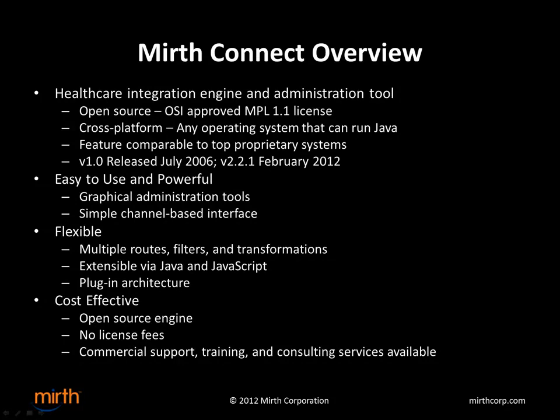So first I wanted to give a little bit more information on Mirth Connect. As I've already mentioned, it's a healthcare integration engine, and it's also an administration tool for configuring that integration engine. It's open source, which means all the source code is available to you. You can download it online, you can look at it, modify it if you like, build it yourself if you want to. It's an OSI approved license of MPL 1.1.